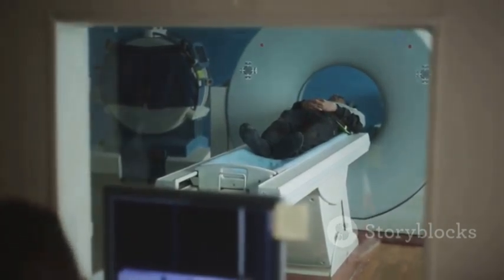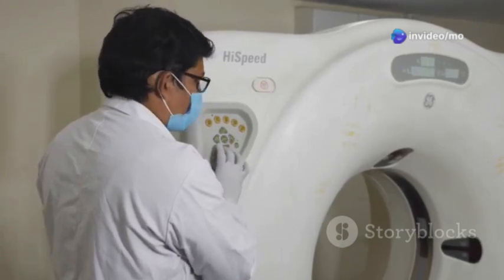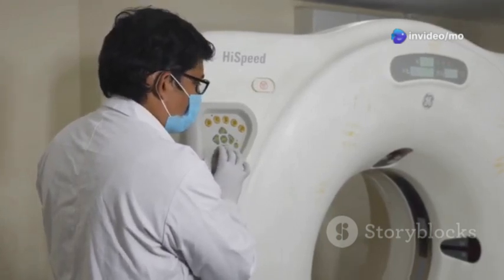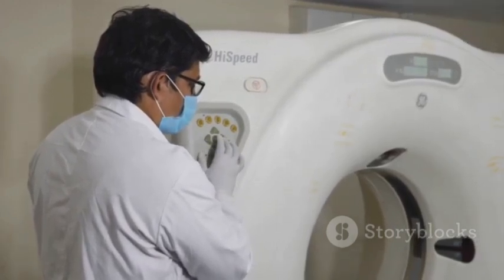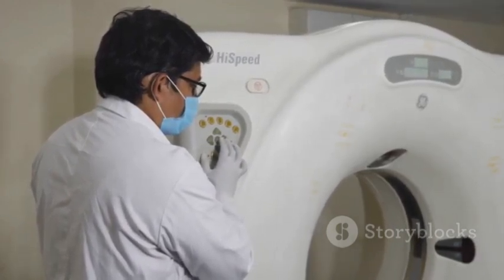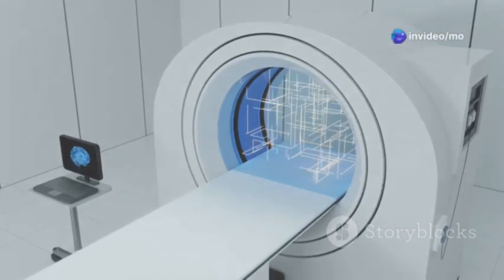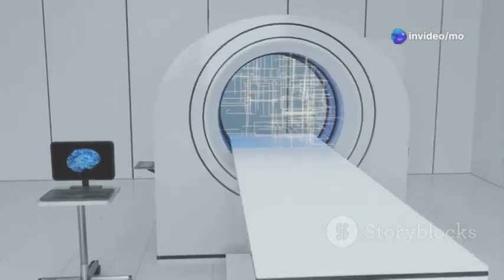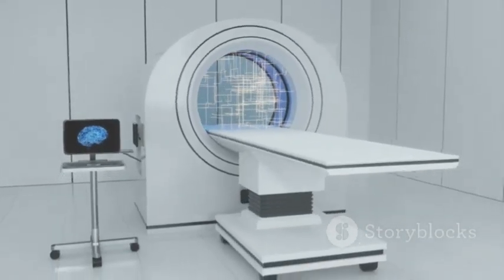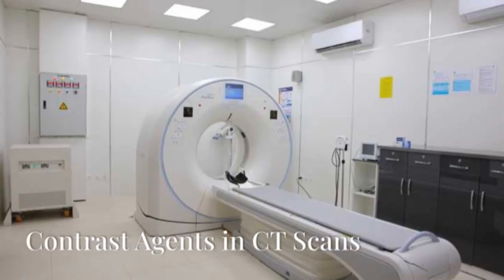situations, especially emergencies. Despite their limitations, sequential CT scanners still hold value in specific applications, particularly in situations where precise alignment of images is crucial, such as radiation therapy planning. However, with the advancements in helical CT technology, sequential CT scanners have largely been replaced in modern medical practice, paving the way for faster and more efficient imaging techniques.